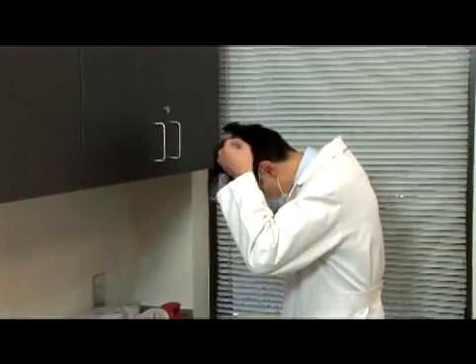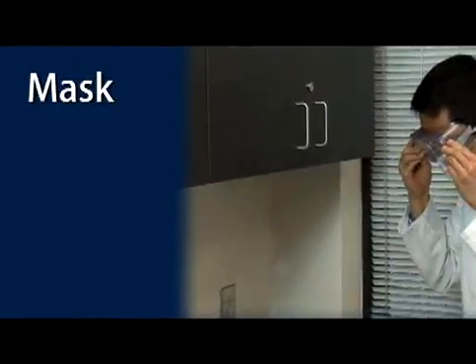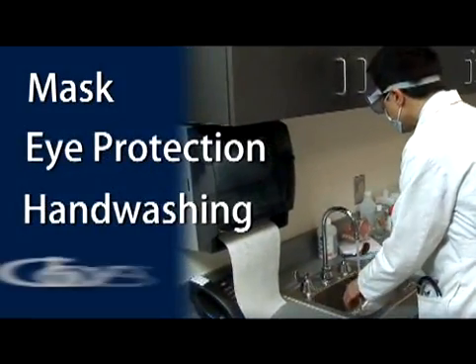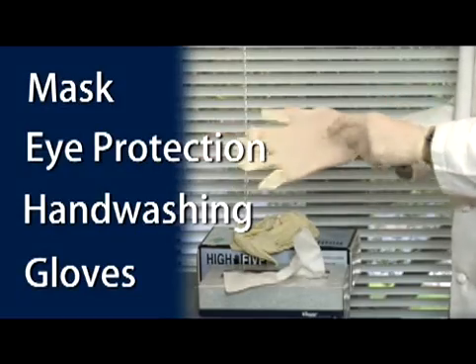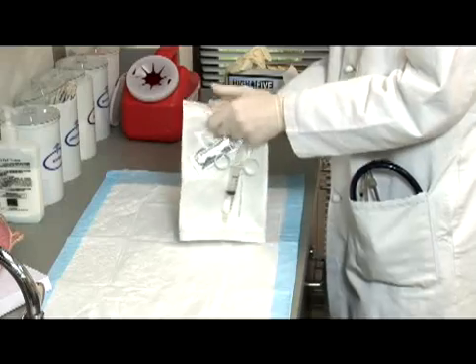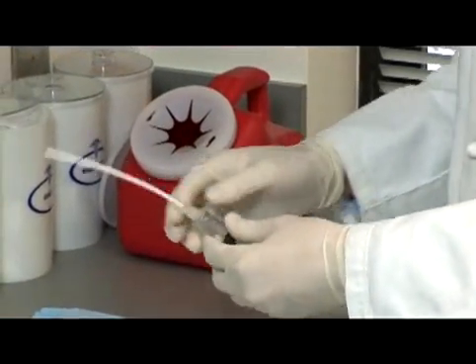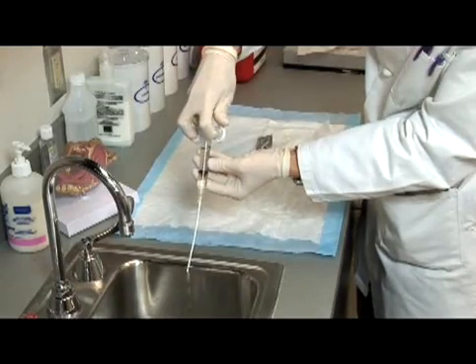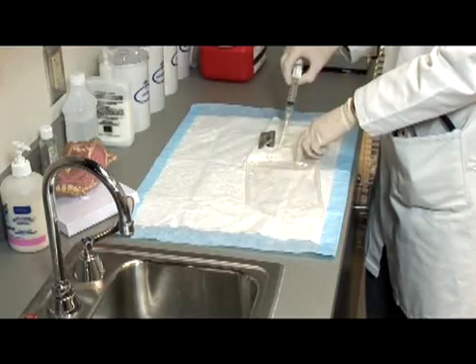When collecting the nasopharyngeal aspirate, follow these steps. First, put on your mask and eye protection. Following hand washing, put on your gloves. Open the sterile aspirate kit and attach the tube to the syringe. If necessary, slowly expel excess saline through the tube until a volume of 3 milliliters remains in the syringe. Lubricate the tube with lubricating jelly supplied in the kit.